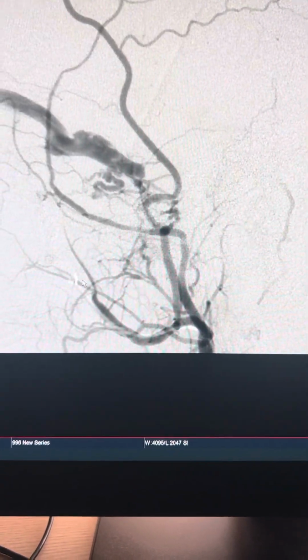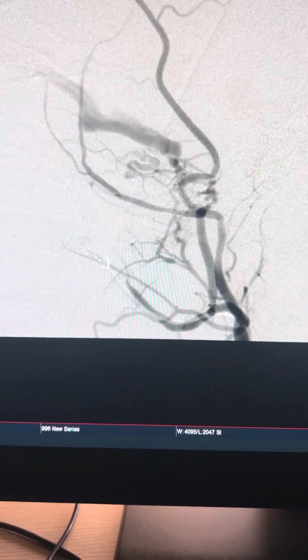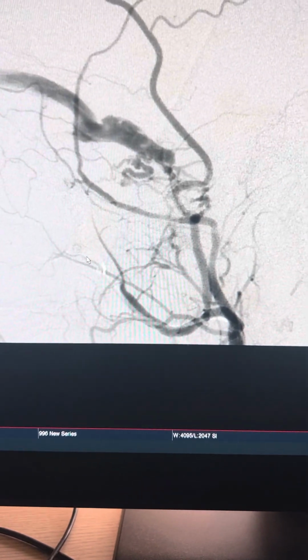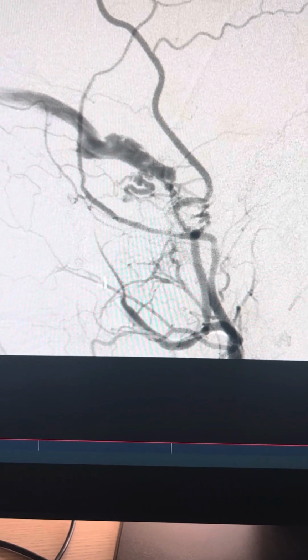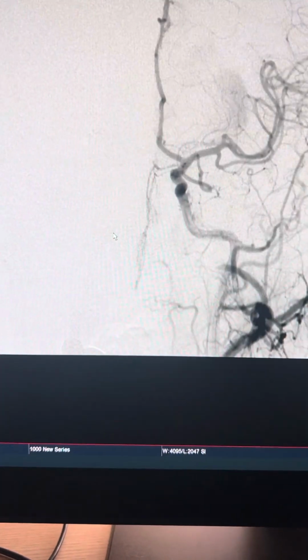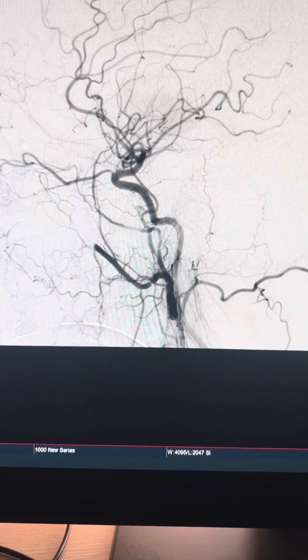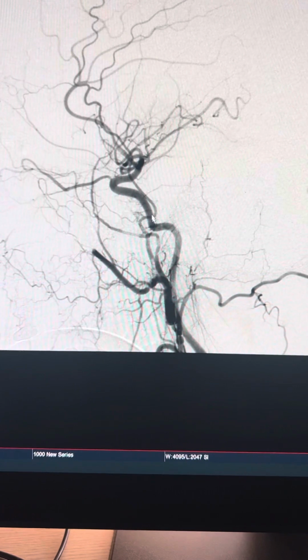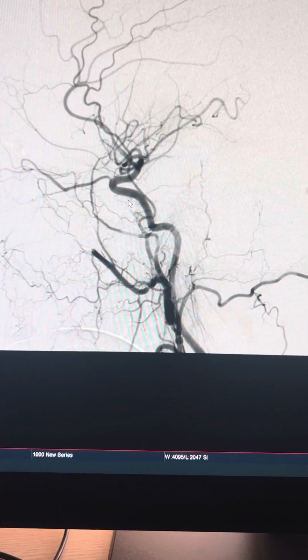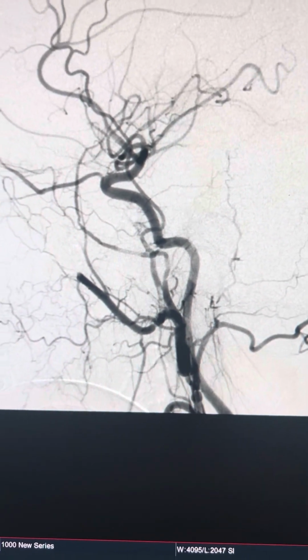So as you can control this embolic material that you can probably appreciate over here, this is the balloon slightly inflated. Little by little you could achieve more and more penetration into this arteriovenous malformation or vascular shunting. And as we were able to control this, you can see now the cutoff, it went in all the way into those branches, and there's some reflux back into the internal carotid, and even the internal carotid now, that small branch we were seeing in this location is no longer filling.